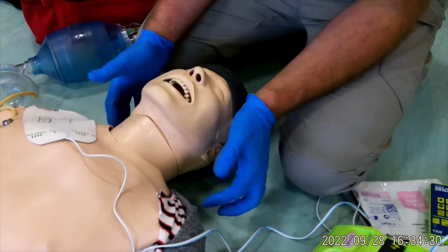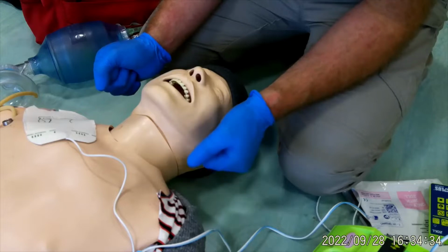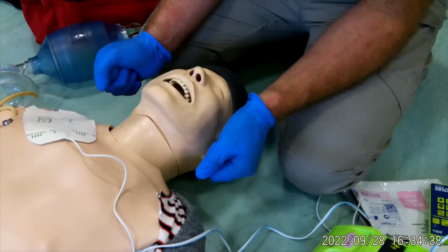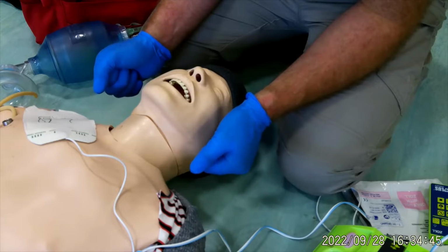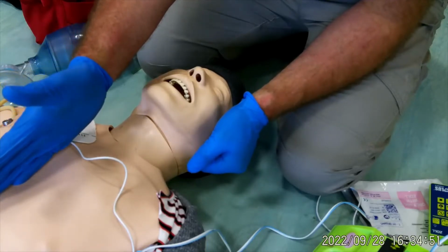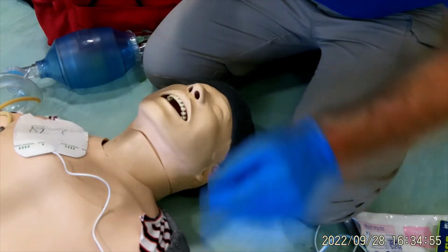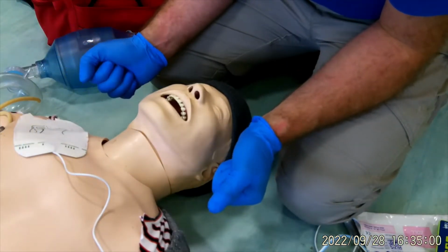So welcome to this video where we've already established our patient is in cardiac arrest, done our dynamic risk assessment, moved them from a confined space, reassessed the airway, removed clothing, used an AED to shock the patient and do chest compressions. Now I've got a colleague, someone else is doing chest compressions for me. I'm going to concentrate on just the airway. So continuous chest compressions are going on. We know that defib will reanalyze every 2 minutes.